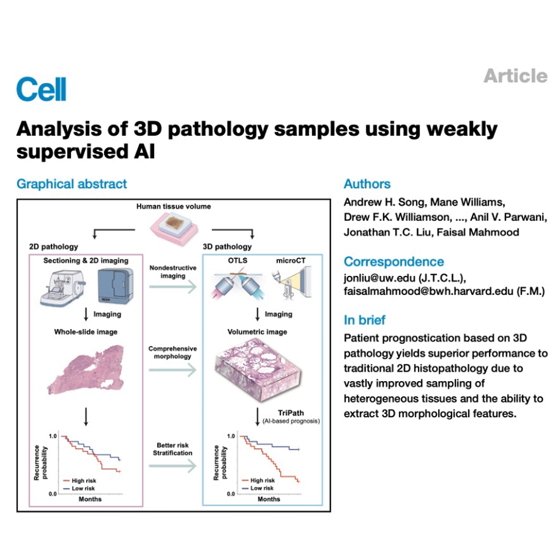Okay, so we solve the not enough data problem of 2D, but we run straight into a too much data problem. Precisely. These aren't just images, they're gigavoxel data sets. Billions of data points per sample.